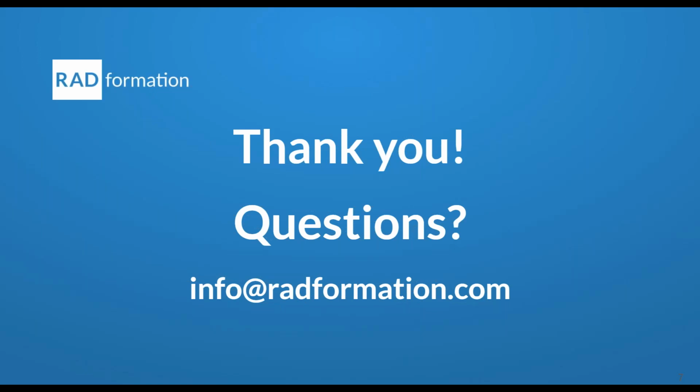Sounds good. All right. And here's another question from an attendee. They look like they're a current ClearCalc user, and their fields in ClearCalc appear in alphabetical or numerical order. Is there a way to keep them in the order they appear in Eclipse? Yeah, so we have the same thing in ClearCheck, right? So the API sends us the fields and typically not in the order even that they are in the API.